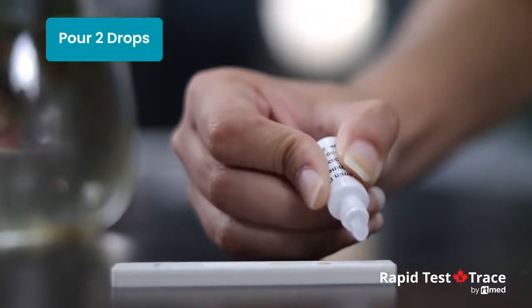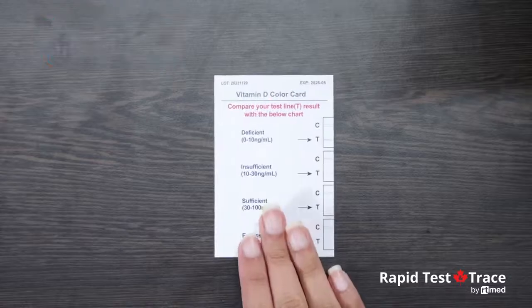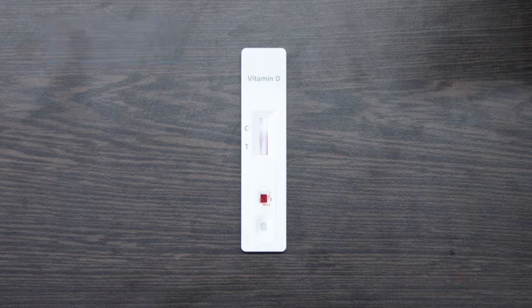Start a timer and wait for the colored line to appear. Read the results in 10 minutes and compare the T-line intensity with the vitamin D color card provided with the test kit to get the vitamin D deficiency level of your blood. Note that this test provides an approximation of the vitamin D deficiency level — do not interpret the results after 20 minutes.